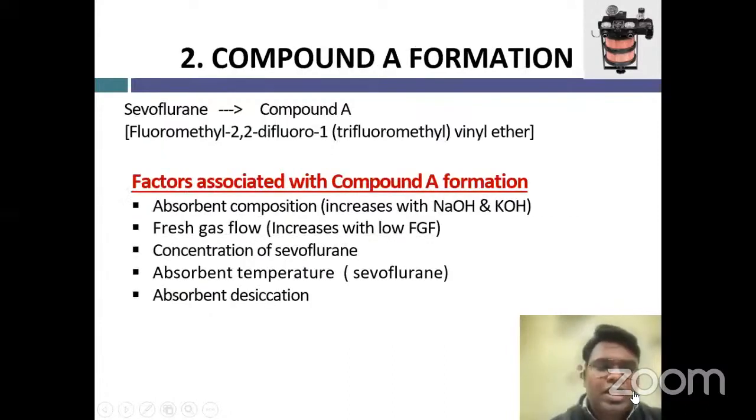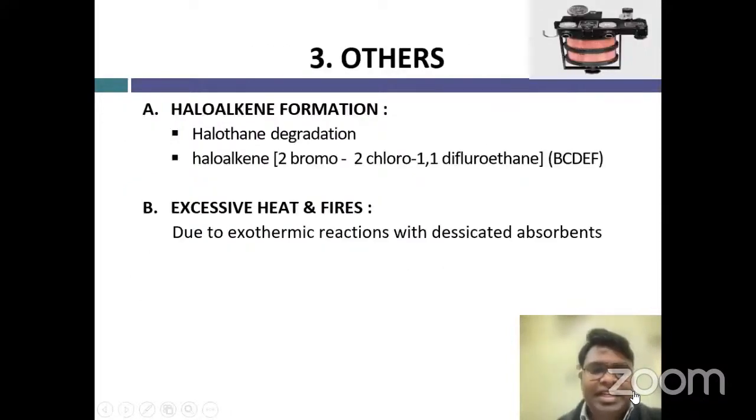With desiccated soda lime, sevoflurane can undergo base-catalyzed degradation into fluoromethyl 2,2-difluoro-1-trifluoromethyl vinyl ether, also known as compound A, which is known to be nephrotoxic to rats but not to humans to date. Halothane may degrade into 2-bromo-2-chloro-1,1-difluoroethane. Excess heat and fire may be noted with desiccated absorbers.